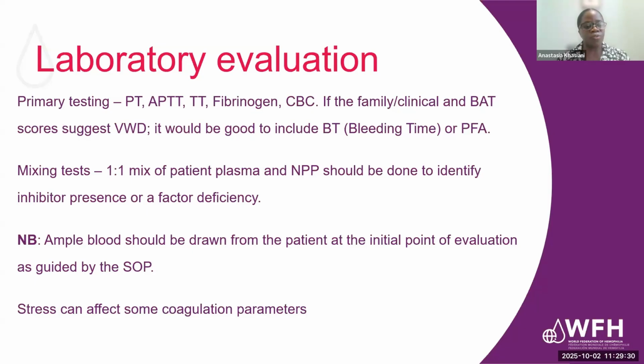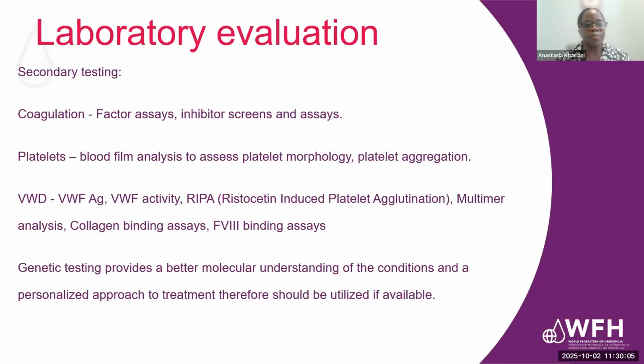Some important information to note is that you are supposed to collect enough sample at the initial point of meeting the patient so that you do not go back to collecting more samples, because sometimes you're supposed to do further testing for that particular patient, and therefore collecting enough sample at the initial point will be good. And stress can affect some of the coagulation parameters, and therefore ensure that the patient is calm when you're collecting the blood sample. Next slide, please.